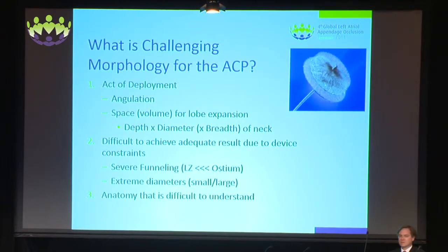So what is the challenging morphology for the ACP? I'm going to center on the ACP in this talk, because I think the other devices are beyond the scope of the time that I have. So I'm going to divide that into 3 steps.